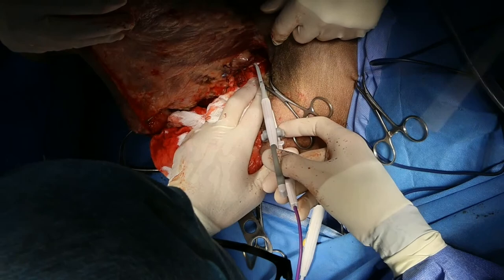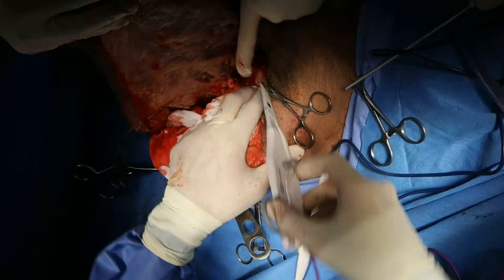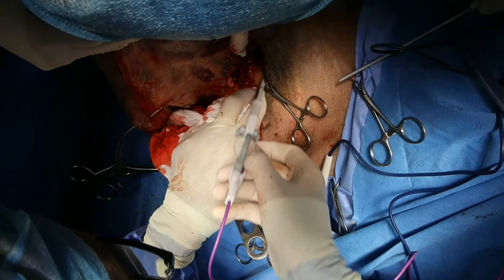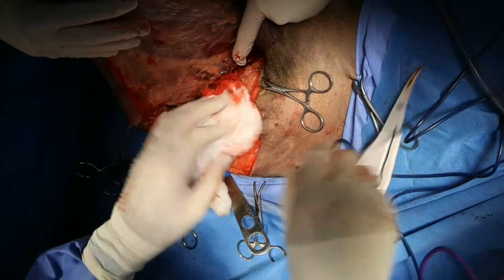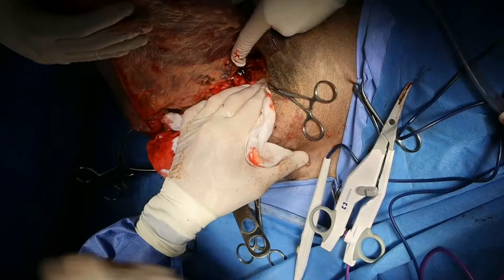So that you can see the iliolumbar vessel right in here. We can see it, you can't. And that comes around over the top of the acetabulum. I would love to ligate that. Just grab a right angle. Let me just get another pack of silk, I reckon.